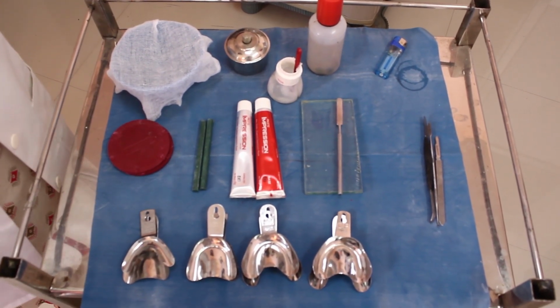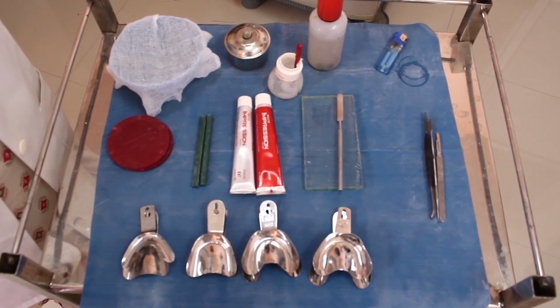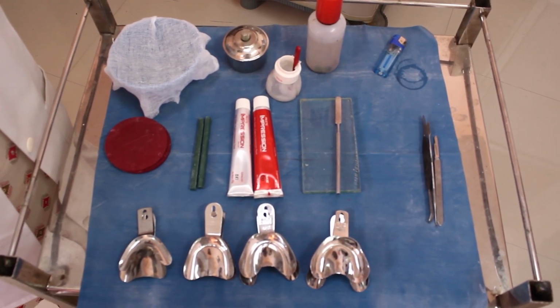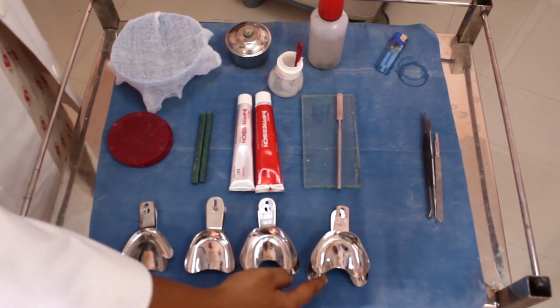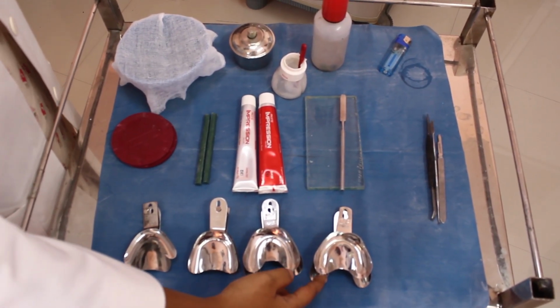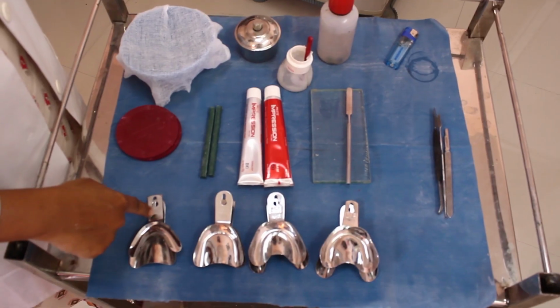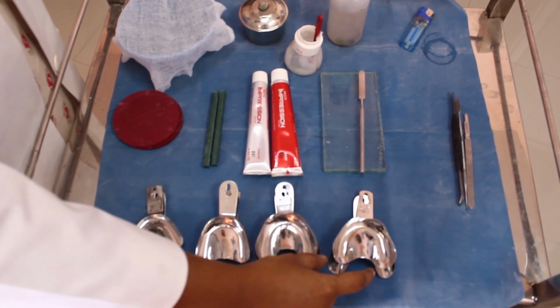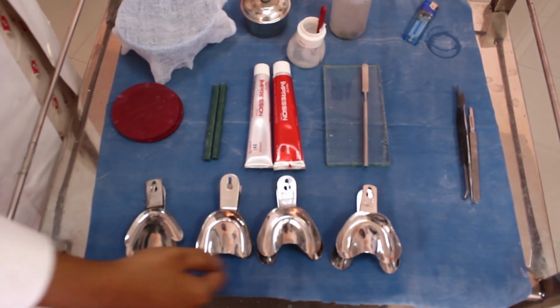Today we are going to see the demonstration of primary impression for the complete denture. To start with, we are going to see the armamentarium for this procedure. Here you could see the impression tray. This is like LC1, 2, 3 and 4. According to the diameter, we will decide upon which of the trays to be used.